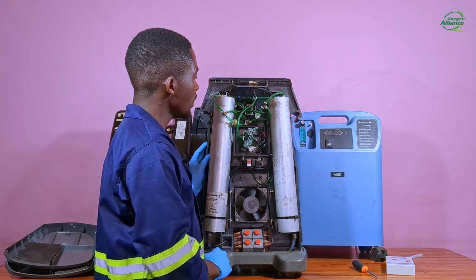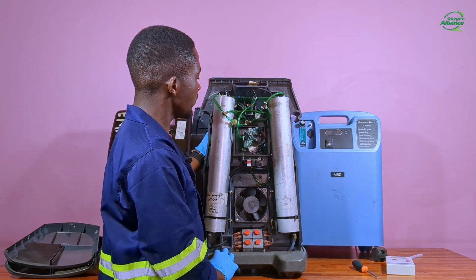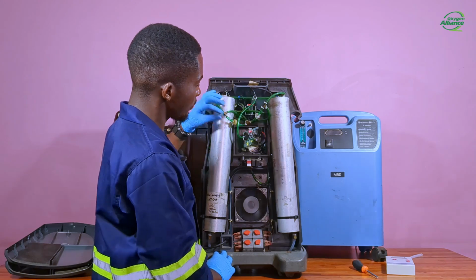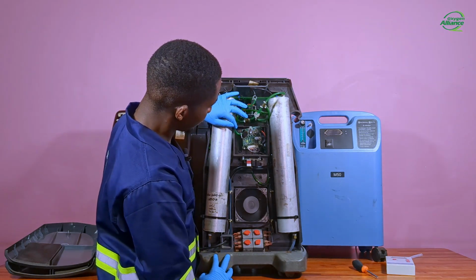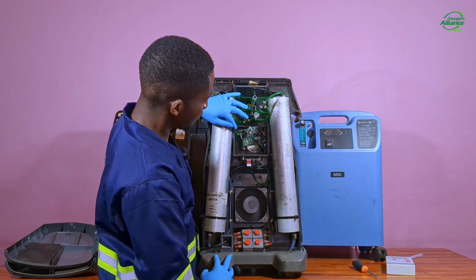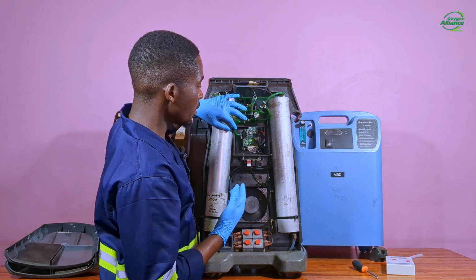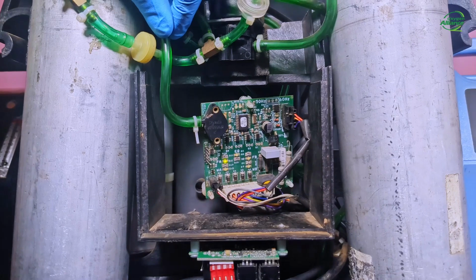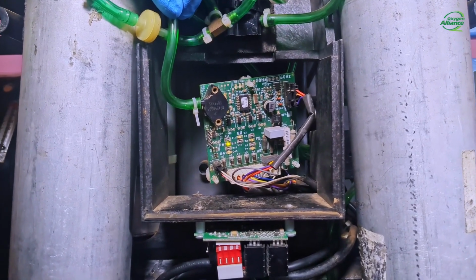Now I'll turn on the machine and observe how the board will behave. The first thing that you have to check are these 5 LEDs that correspond to how the control valve is functioning.